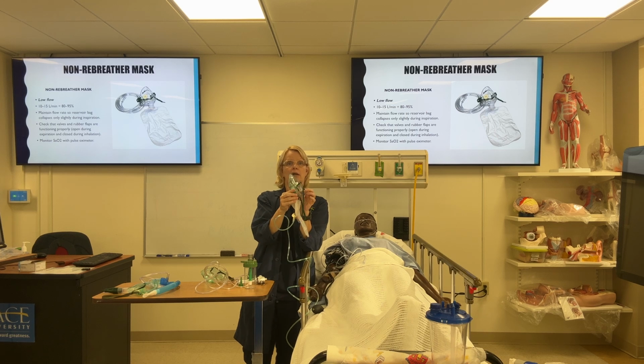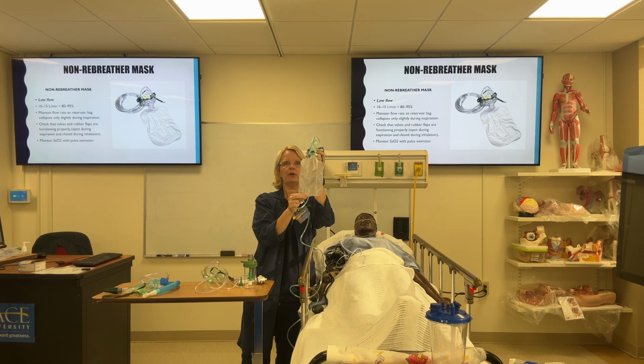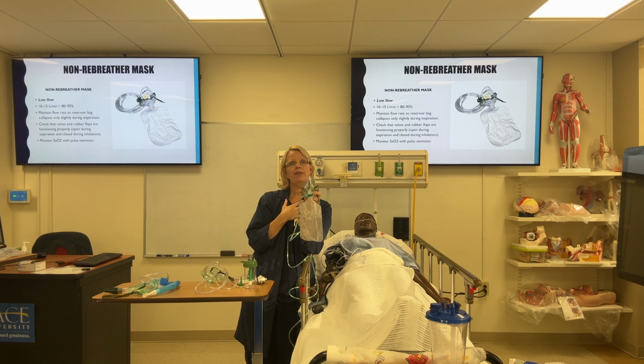Now, why? Here's why. When you're breathing out of this particular mask, the oxygen is flowing into the bag reservoir. There is 100% oxygen flowing into this reservoir. When I take a deep breath in through this mask, those little flaps are going to close over those little hole openings. When the flaps close over the openings, it is preventing me from breathing room air and mixing it with my 100% oxygen. So I am only breathing 100% oxygen when those flaps are on. When you take a deep breath in, that is considered negative pressure, so it's causing the flaps to suck closed.